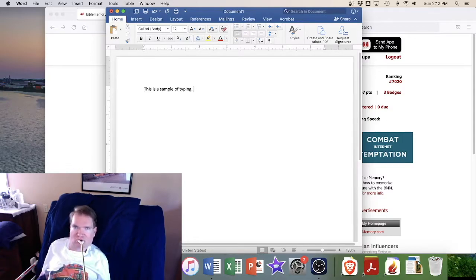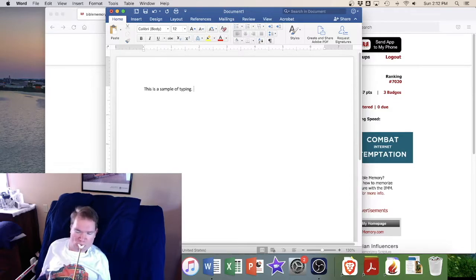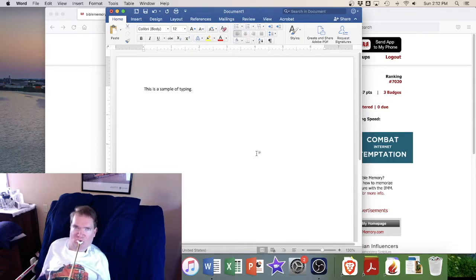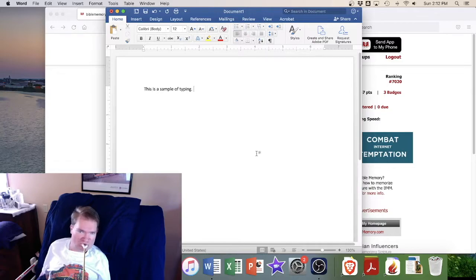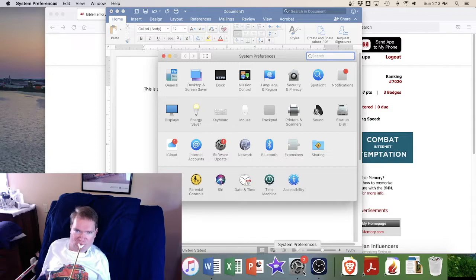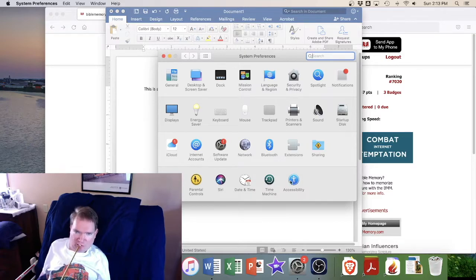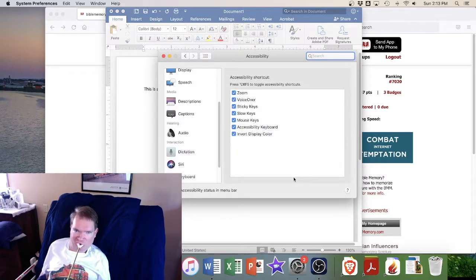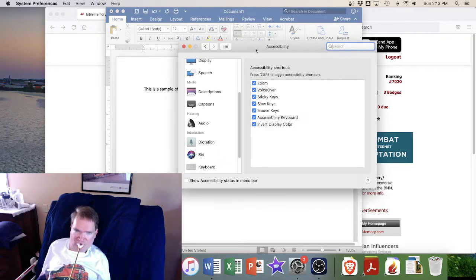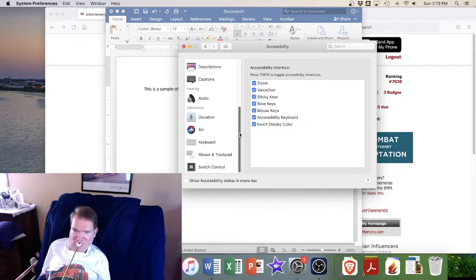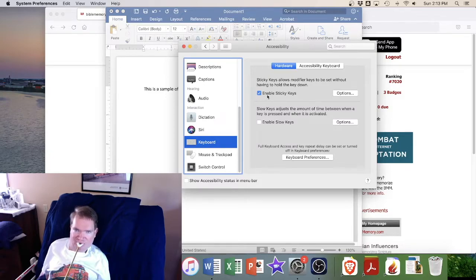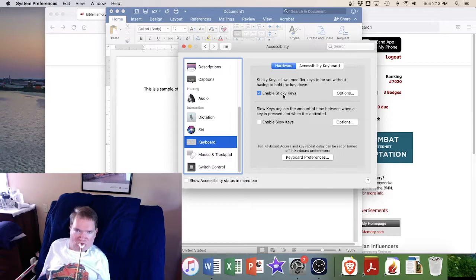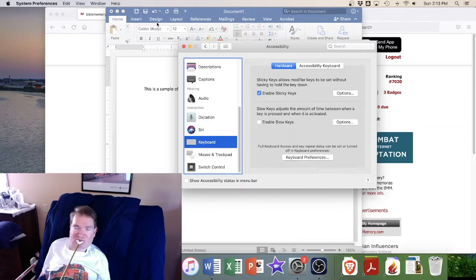So in order to do that I use something that is called sticky keys. And that is available on both Windows and Macintosh computers. So on Mac here if you go to system preferences and then go to accessibility, you'll get several different options here on the left to choose from. But if you go to keyboard you can see a check mark for enable sticky keys. And what sticky keys does is makes it so I don't have to hit two keys at once.